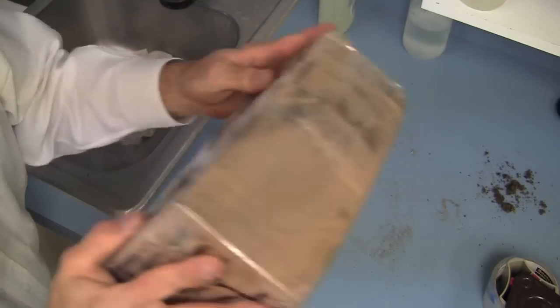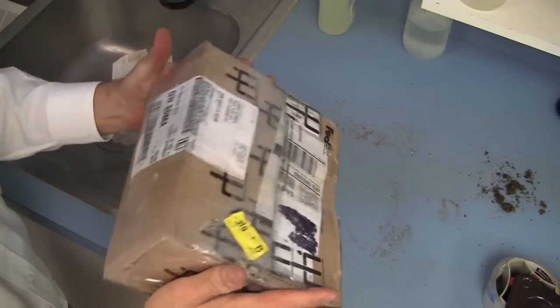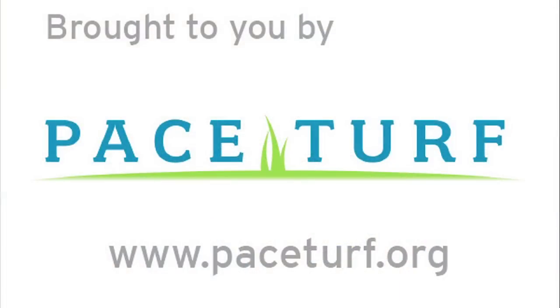There's the box — no shifting, no leakage, everything's good. Refer to the links associated with this video for a listing of turf disease diagnostic laboratories and their websites. You can refer to these websites before you ship a sample to make sure that you provide all the information that each diagnostic lab would like you to provide with the samples. We hope you enjoyed this video. Thank you.